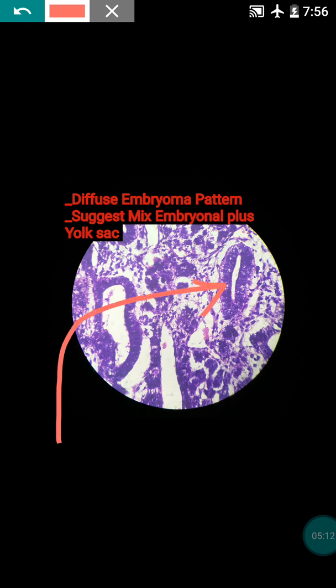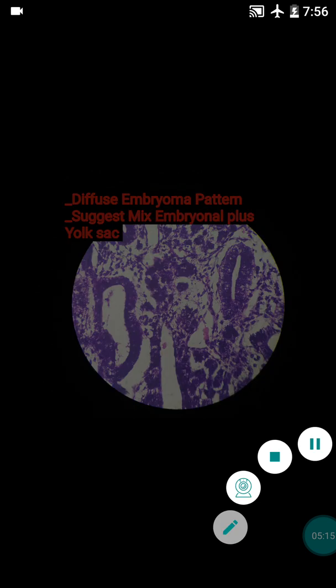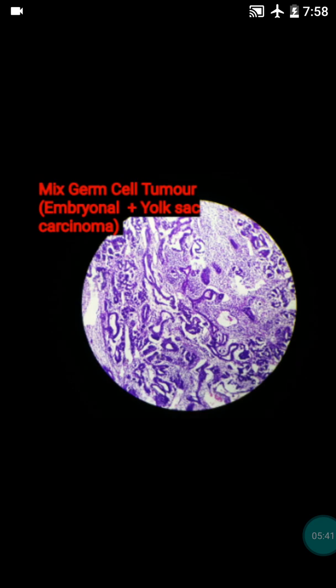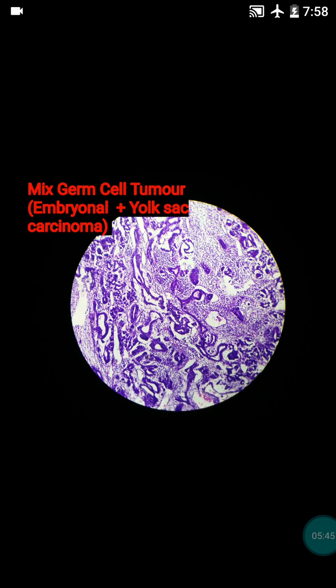This is the diffuse embryoma pattern, seen in the mixed embryonal plus yolk sac tumour, suggestive of mixed embryonal germ cell tumour. After extensive analysis and discussion, both pathologists gave a final diagnosis of mixed germ cell tumour — embryonal plus yolk sac carcinoma — made by clinical correlation and observation of various fields.